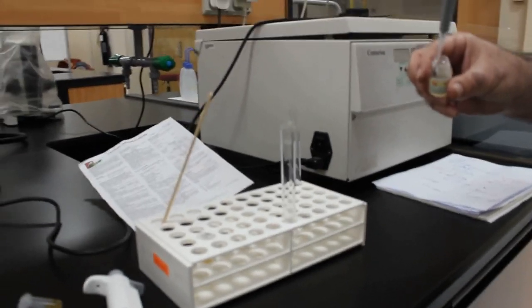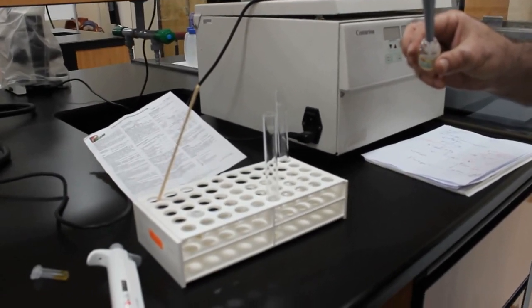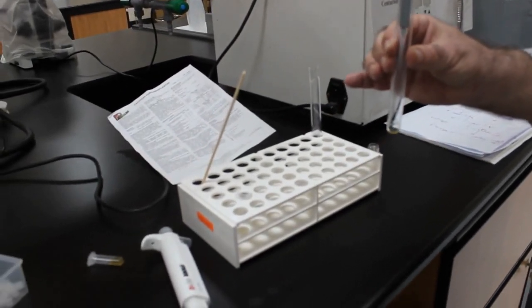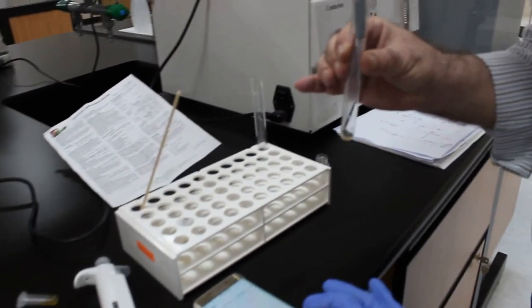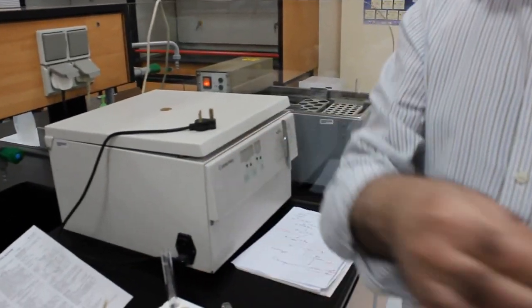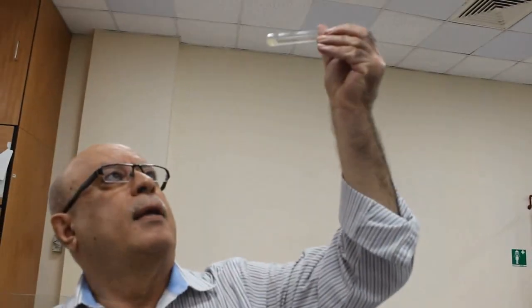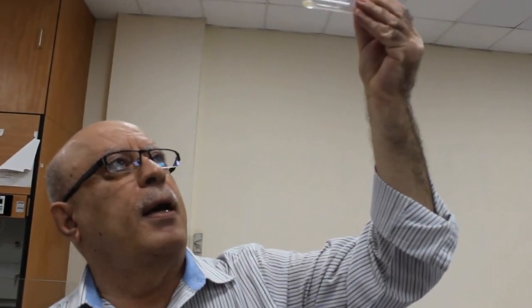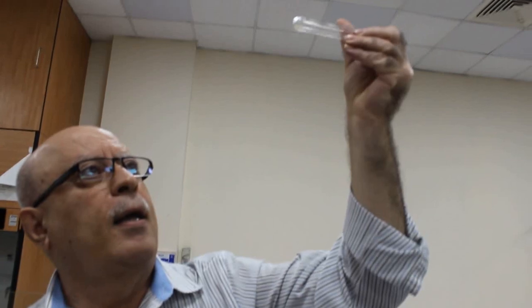We add 200 microliter of reagent and immediately look for a clot. As soon as we see a clot, we have to mark the watch. I can see the clot right now. I can see the clot formed right now.